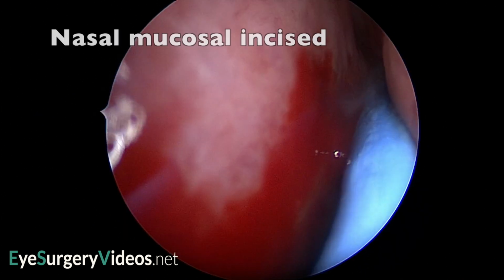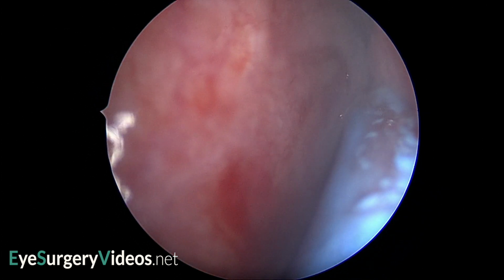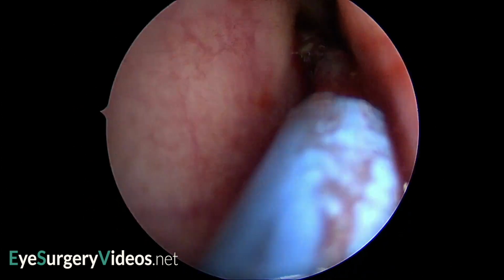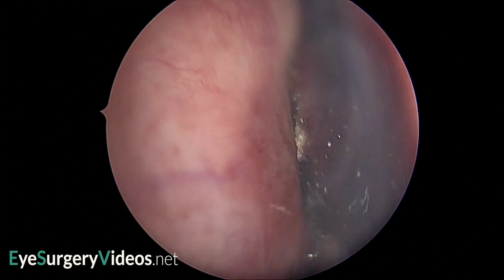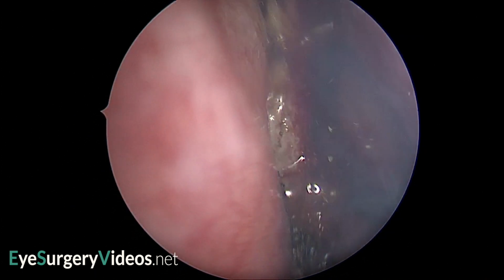The lateral nasal wall appearance is initially unremarkable in this case. A routine nasal flap is cut with a guarded monopolar diathermy needle and then raised to expose the frontal process.